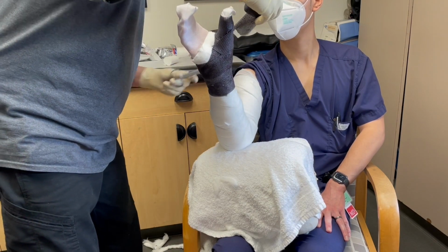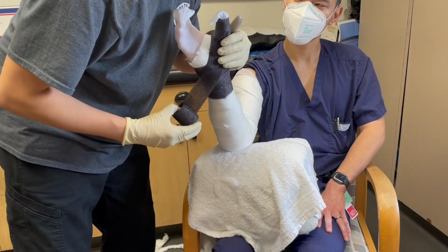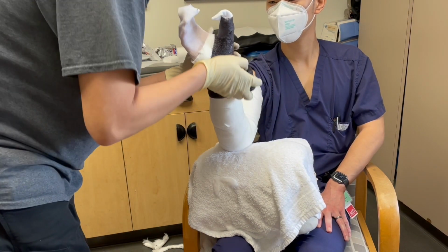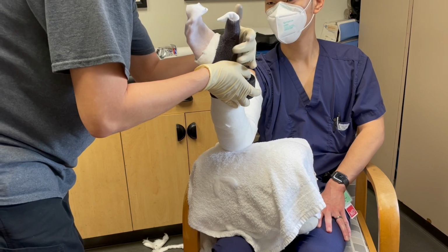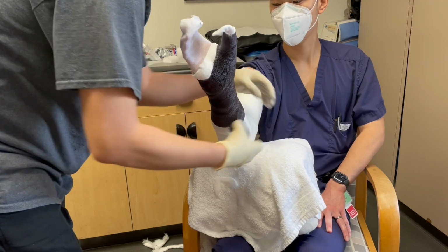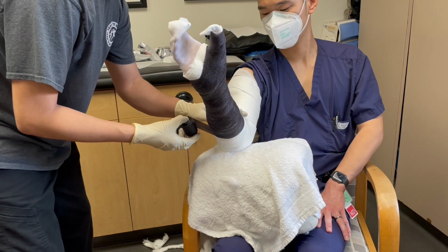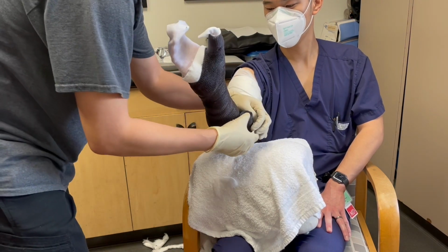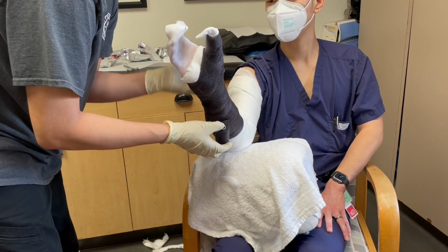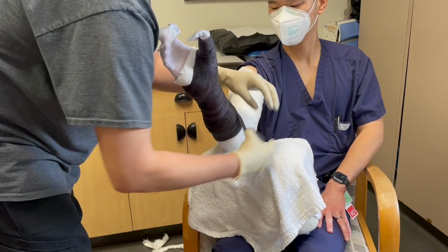You can add one more layer on top of the thumb with another L cut, wrapping down proximally with 50% overlap over the last layer. If we stopped here, this would complete the short arm thumb spica cast.